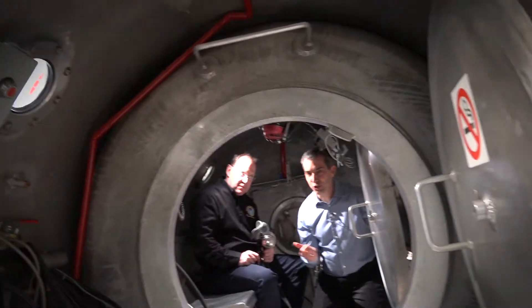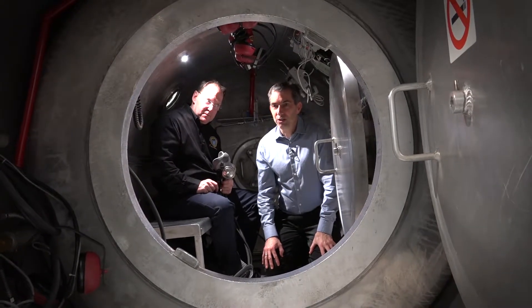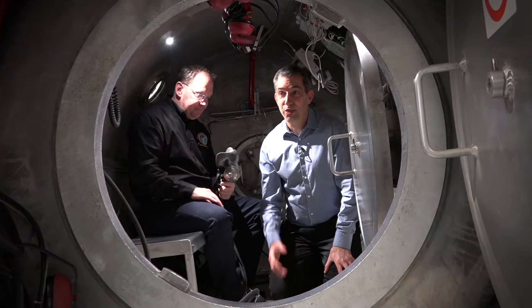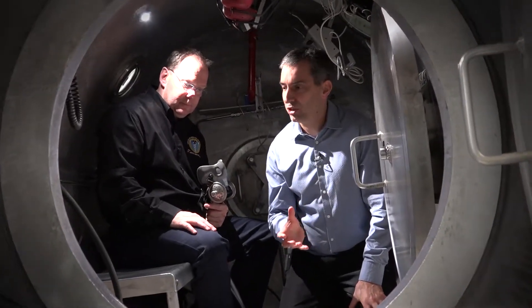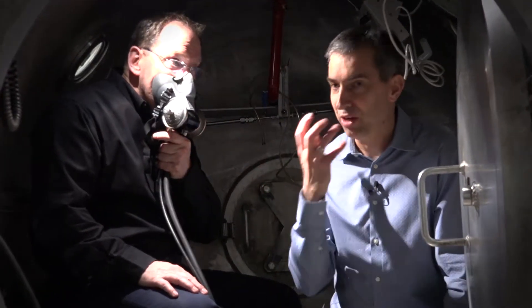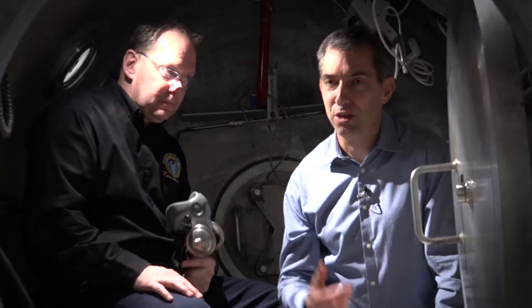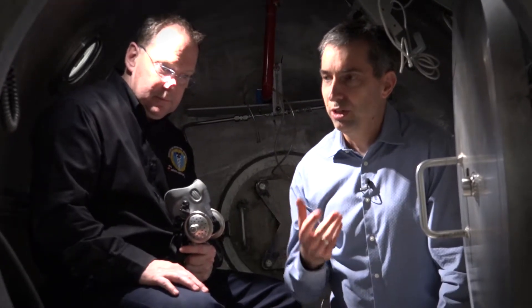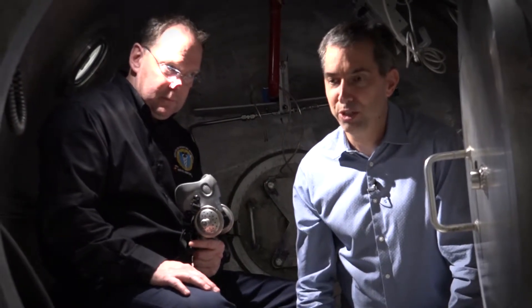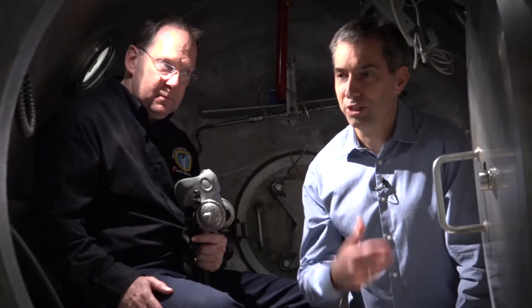We'll bring the injured diver to a pressure usually equivalent to 18 meters of seawater — about three times the usual atmospheric pressure. The diver will then receive oxygen by a mask, breathing pure oxygen. The chamber will be pressurized with compressed air, and the patient will be receiving oxygen by periods during the entire hyperbaric treatment.